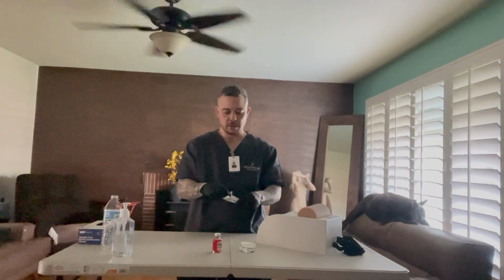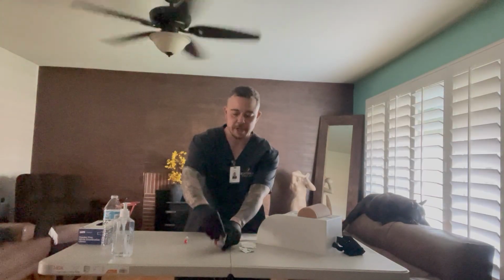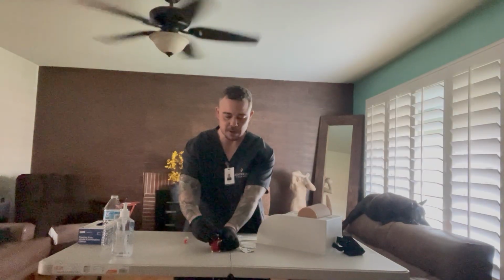Okay, so I have the right syringe here, which is a 1 milliliter 25 gauge by 5/8 needle. Then the next thing I want to do is check my medication bottle to make sure that it's not expired, which it is not.